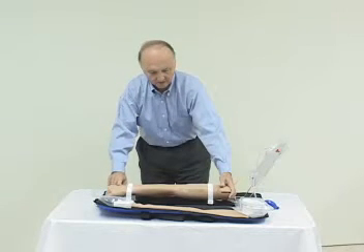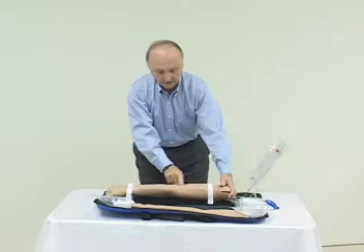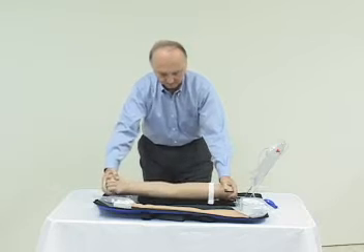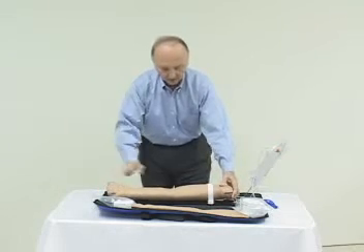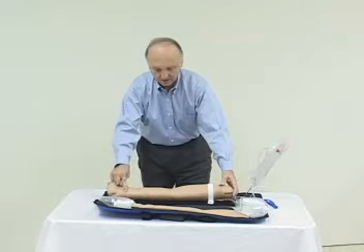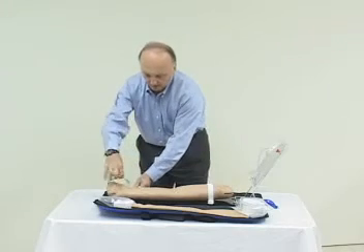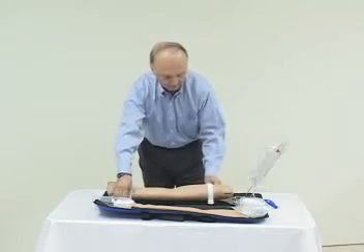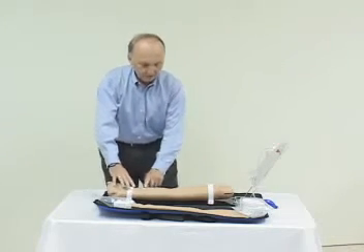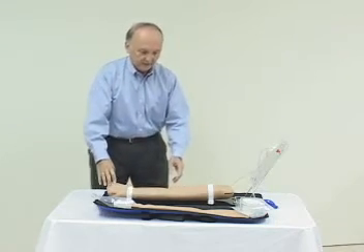We have veins here on the arm. We have an IM site here, an intradermal site here. Moving back around to the initial position, we have veins in this area, veins here, and an intradermal position here. Snap this back into position, and we can use any of these veins for our IV access.